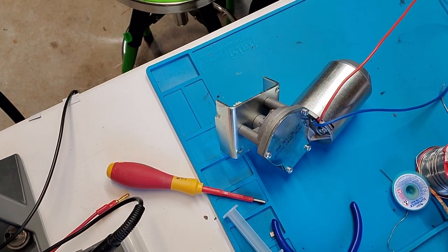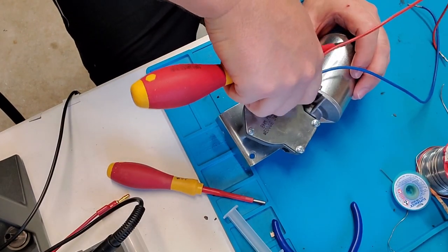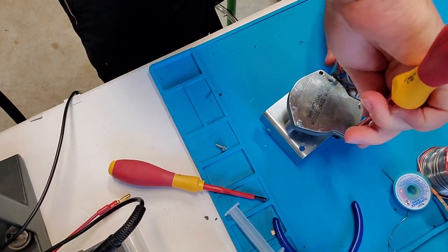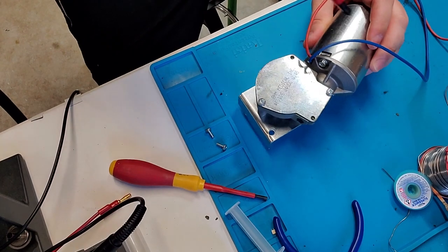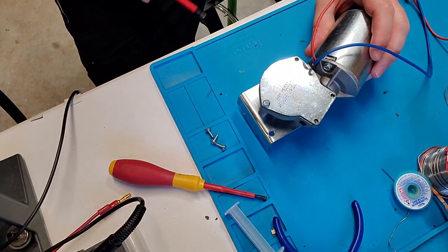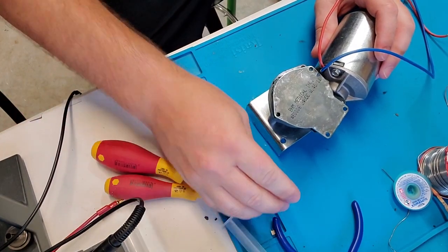so that y'all can see what the inside of one of these transmissions looks like. Remember, when it comes to anything that rotates, you're going to have a proportion of torque to RPMs. You can hear the motor spinning at much higher RPMs than the spur gear. That's because it's got a gear reduction. It reduces the RPMs, and by doing so, it multiplies the torque. That's why the motor sounds like it's screaming, but it's really not moving that fast at the output.